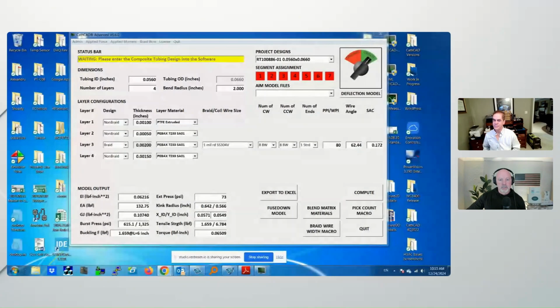All right. Do you see my screen here? Basically, this is CathCAD Advanced. Is this on the screen? Why don't you go one more time and do it? Okay. Window entire screen. Here we go. I got it this time. Okay. There we go. Very good.